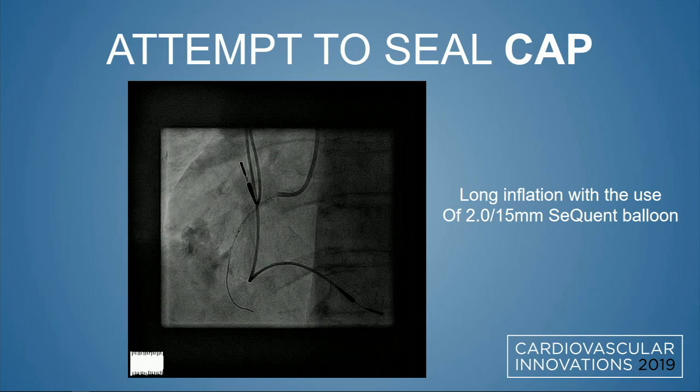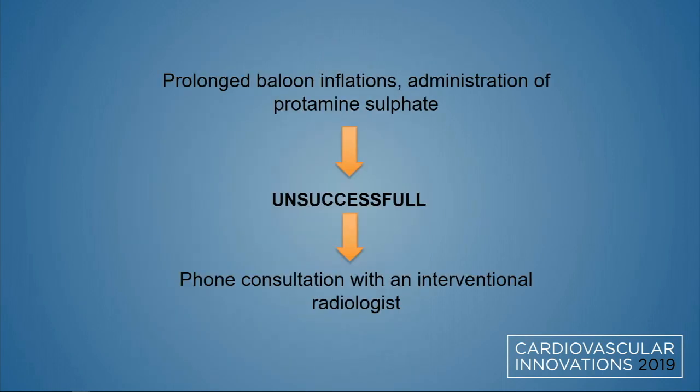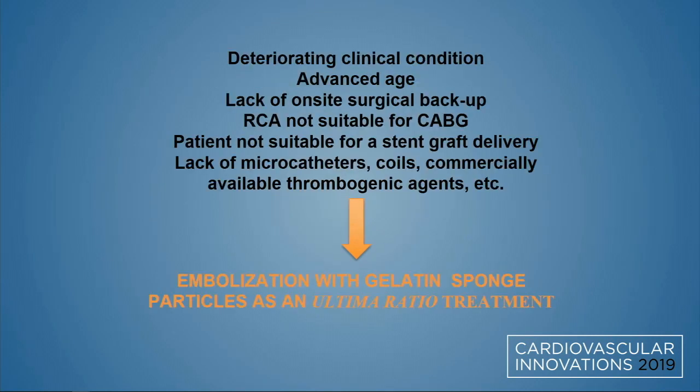Then we took another balloon, a 2.0 by 15 mm Sequent balloon. Despite anticoagulation reversal and long inflations, we still had perforation, so we made a phone consultation with our interventional radiologist.